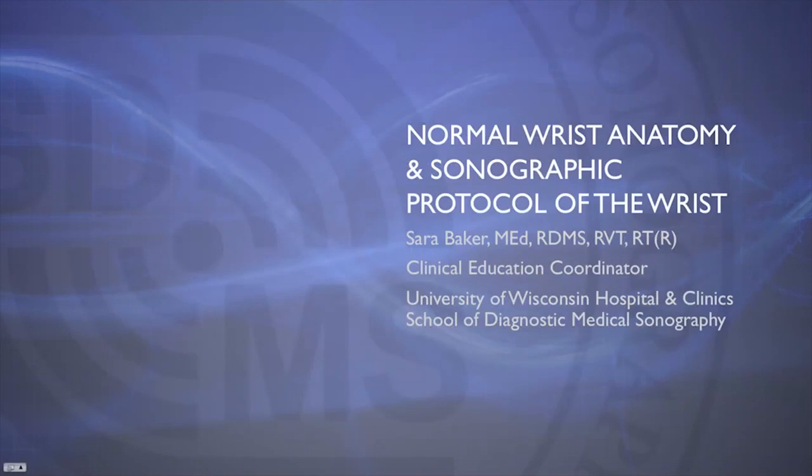My name is Sarah Baker, and I am the Clinical Education Coordinator for the General Vascular Sonography students at the University of Wisconsin Hospital and Clinic's School of Diagnostic Medical Sonography. Today I'll be going over with everyone the normal wrist anatomy as well as the sonographic protocol to evaluate the wrist.